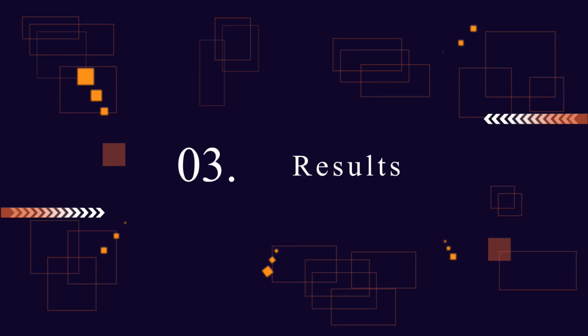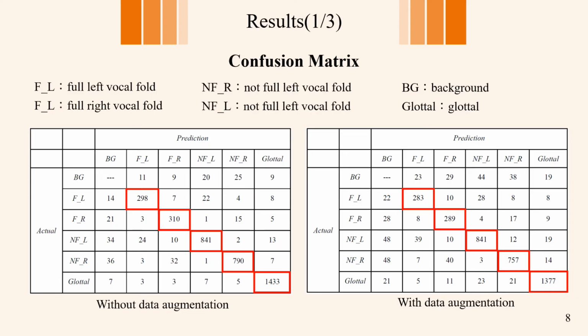In the next section, I'll show the results of our research. Firstly, at the testing phase, we used a total of 1,538 laryngoscopy images from non-training videos as the test data for the model. The confusion matrix of each class without data augmentation is shown in the left table, and the one with data augmentation is shown on the right.